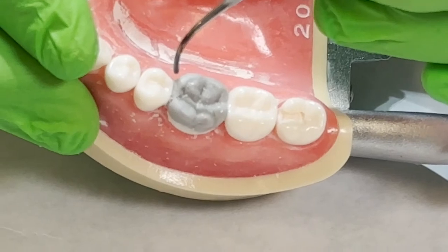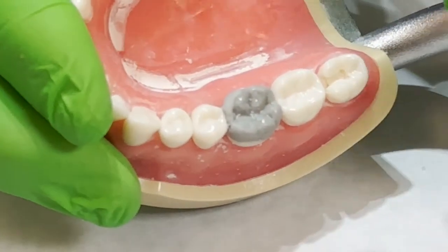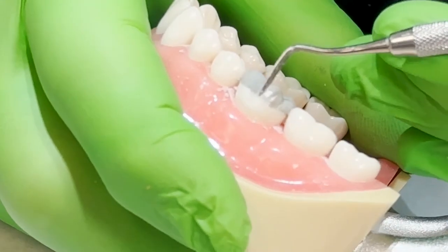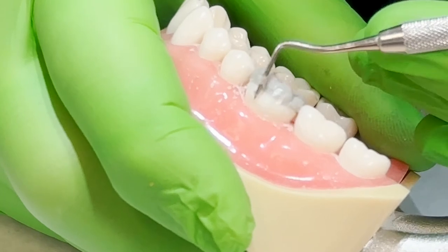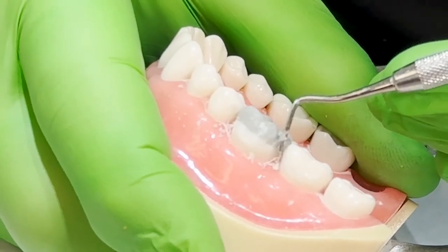Good to check. Does that look right to you? Looks a little weird, but I'm not sure it fits though. I think it's backwards. Good thing I asked. Take it out and turn it 180 degrees.